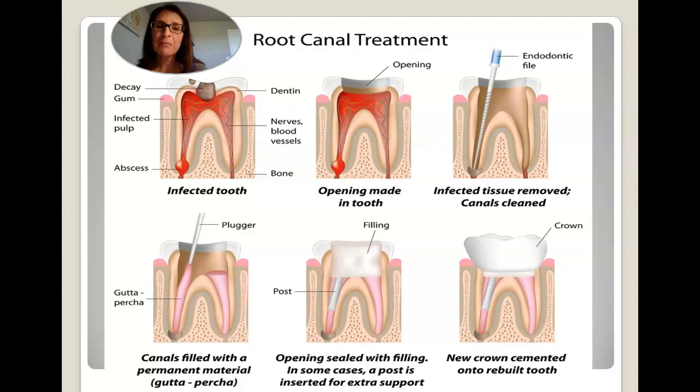And the most common type of irrigation solution that's going to be used is something called sodium hypochlorite. And sodium hypochlorite is basically household bleach, which has been diluted with water. So as we're doing endodontic treatment, because we're using different types of chemicals, we want to make sure that, one, the tooth is being isolated and we're providing good moisture control.